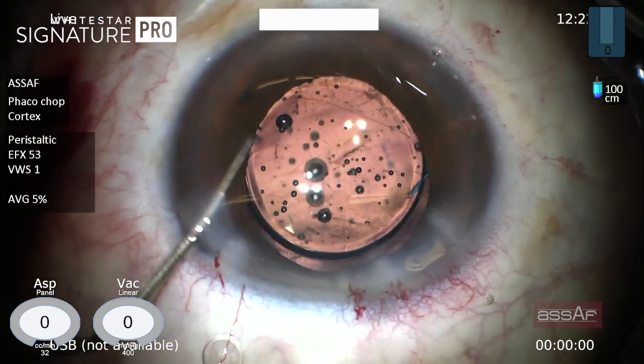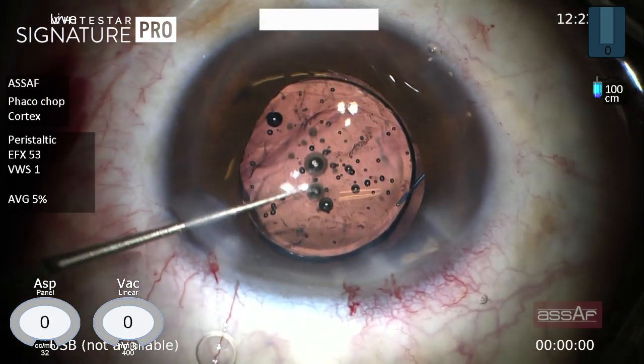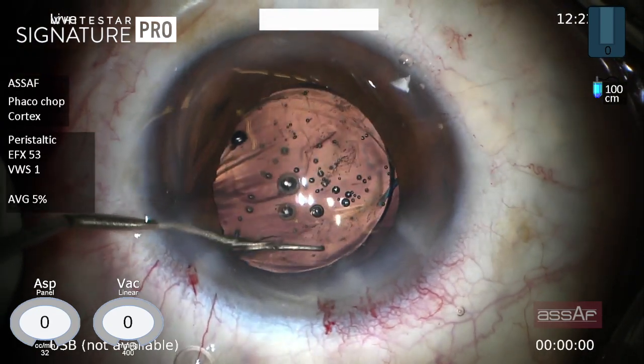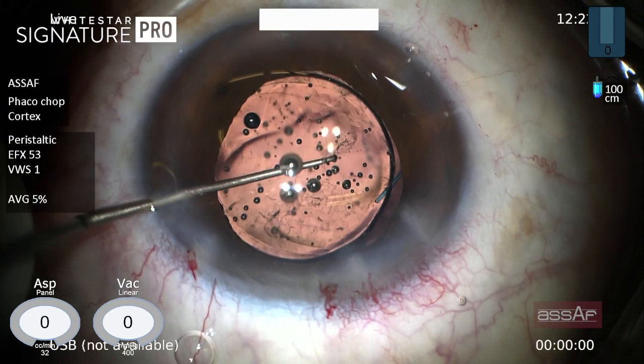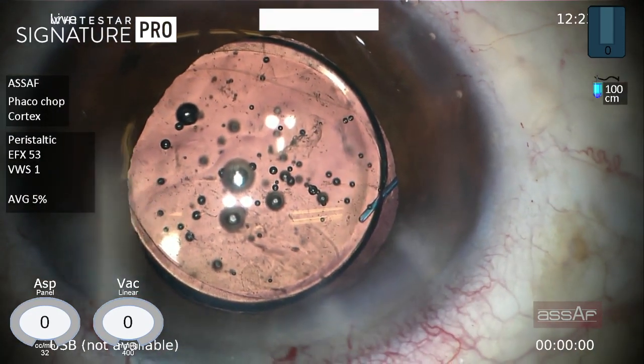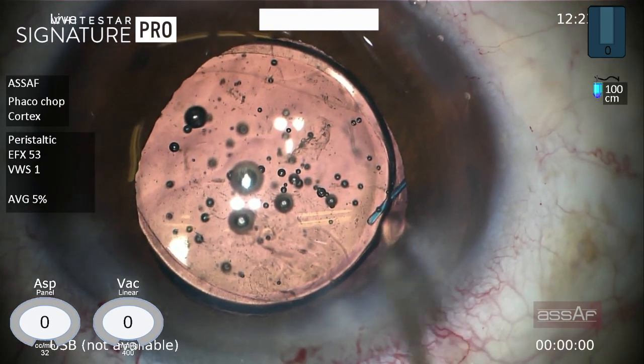Now the lens has been placed in the sulcus. We can do optic capture by pushing on the sides of the optic to bring the optic of the IOL behind the rhexis. As you can see, the lens is very well centered — the optic is behind the rhexis while the haptics are in the sulcus.